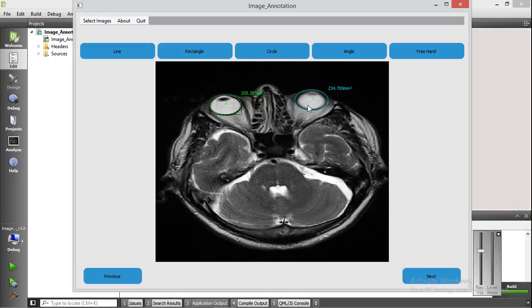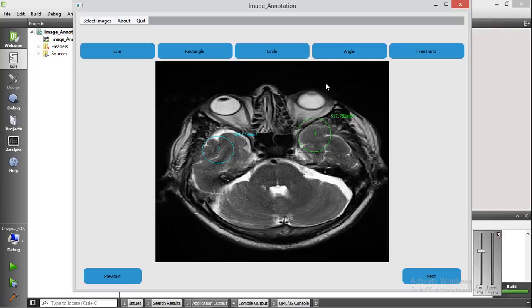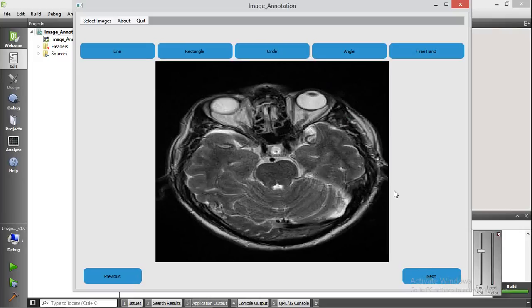You can select these annotations by clicking and resize them. You can also move them. Let me go to the next image. You can annotate the image with an angle by clicking on angle and drawing a line from a reference point. The angle is calculated between the two lines drawn.